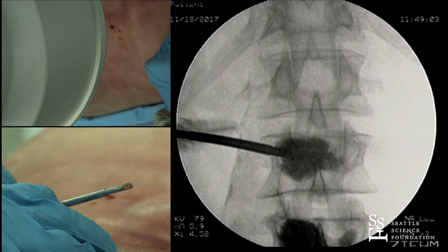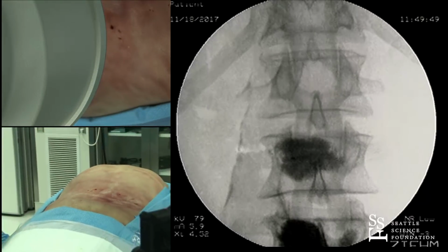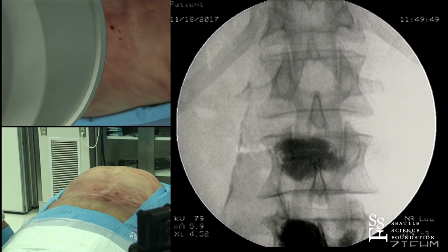The rest of the implant is broken off right there, and the final shot, the final implant, is right there, and we're pretty happy about that. Right, Jason? Those x-rays look great.